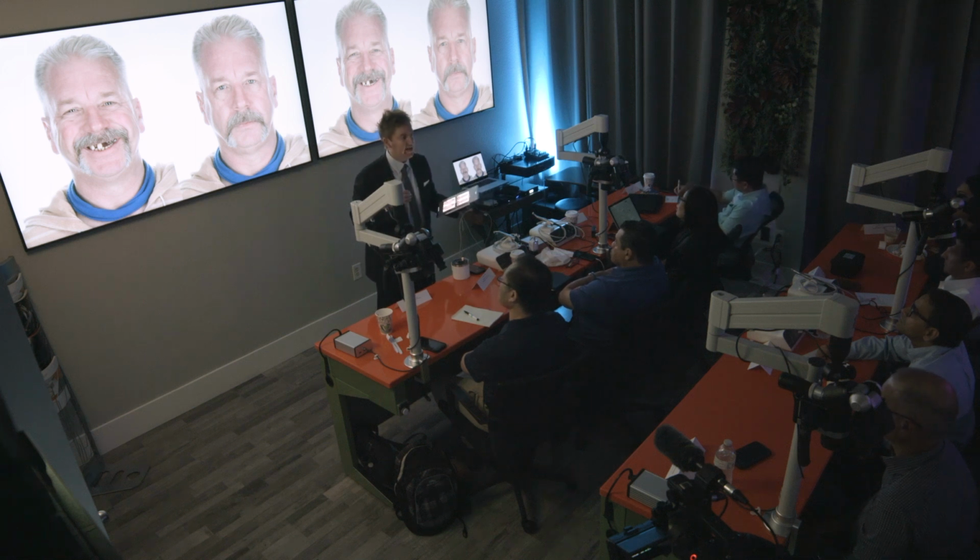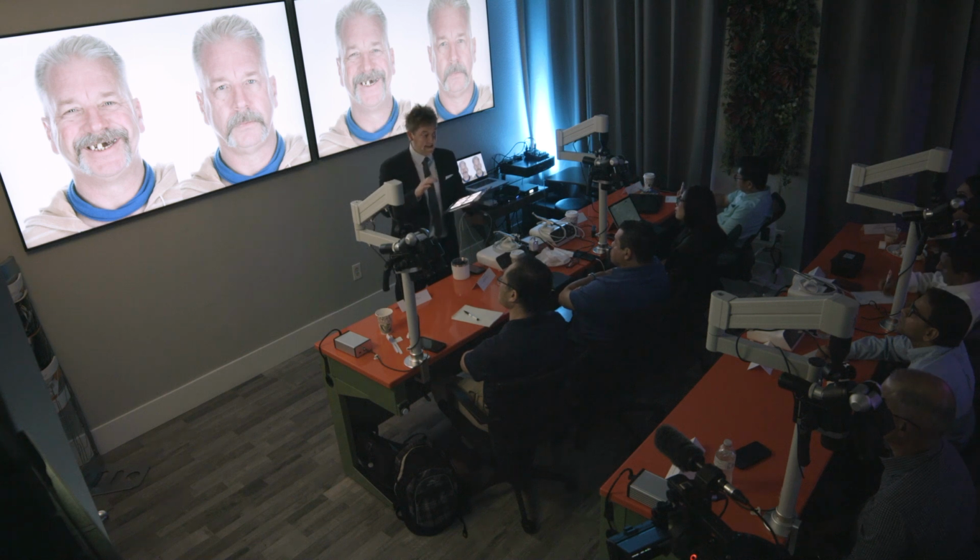So let me give you a little more information. We need to talk about how we were taught to treatment plan patients in dental school versus how we maybe should be treatment planning patients. And we're going to get into that in great detail. But here's his profile. And you and I know that if we look at glabella coming straight down on that profile, we don't necessarily want their teeth proclined beyond that. So he's out a little bit forward.